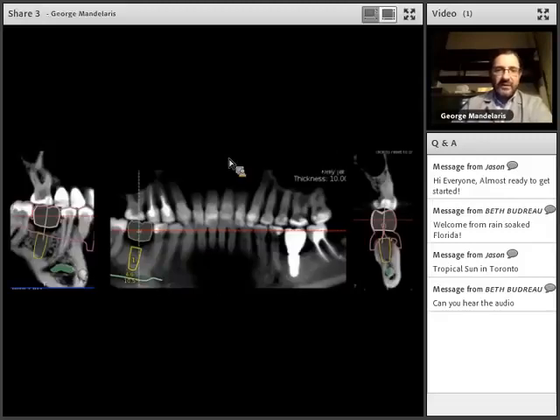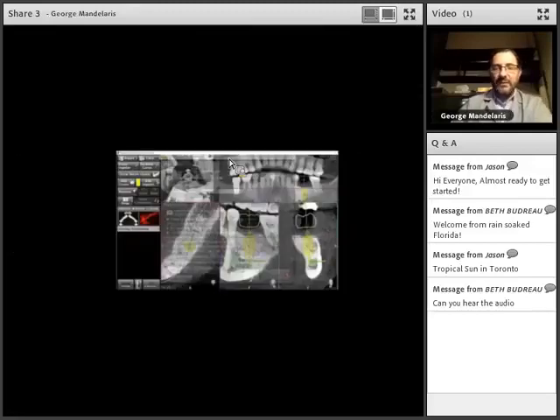So again, you can see that this is the position of the implants, and here's our planning with a prosthetically directed mantra, not just sticking implants wherever they need to go, but this is done consciously with the reference of a tooth, thinking about the restorative dentist first and foremost and making sure that they are successful.